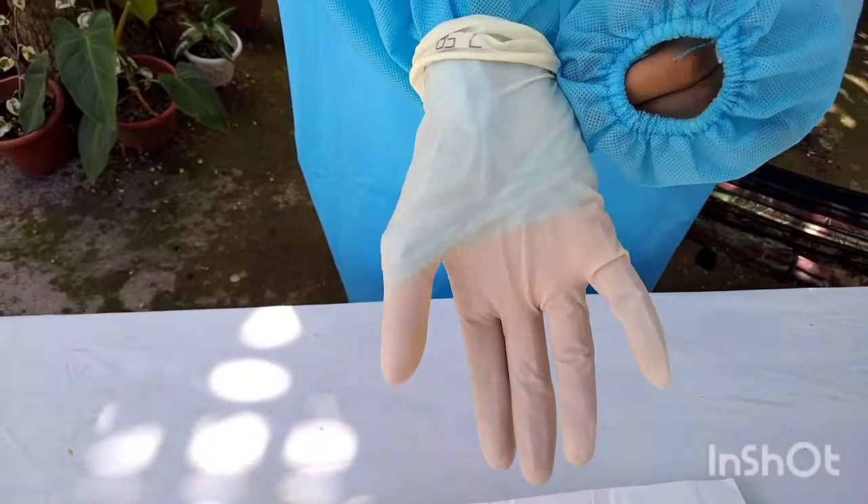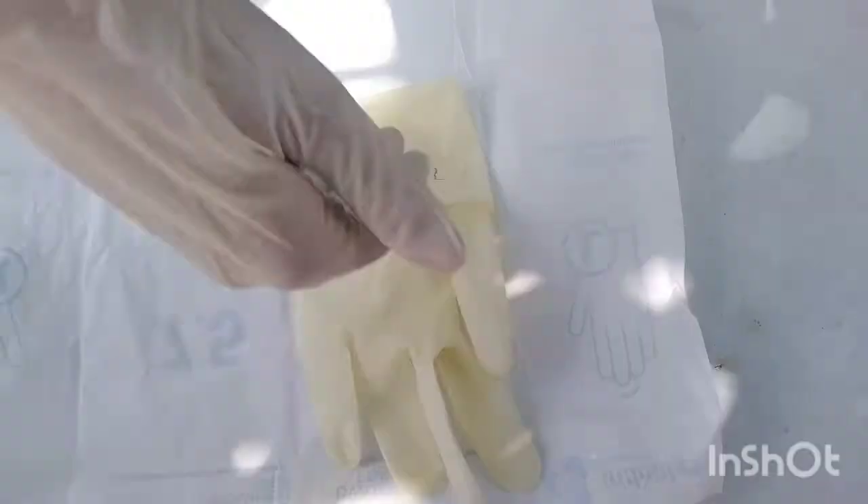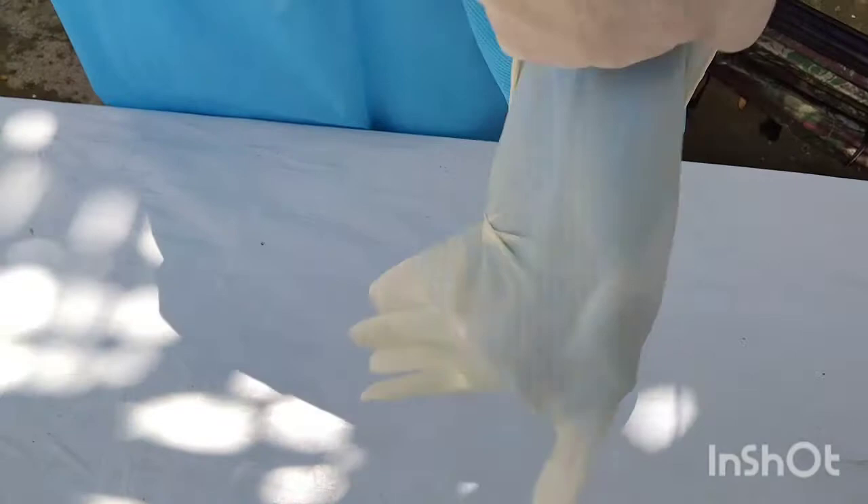Extend the dominant forearm with the palm of the glove against the palm of the dominant hand. Glove fingers will point toward the elbow, palm to palm. Position the glove for application over the hand cuff, keeping the glove sterile. Glove the non-dominant hand in the same manner, reversing hands. Use the gloved dominant hand to pull on the glove. Keep the hand inside the sleeve. This helps sterile touch sterile.